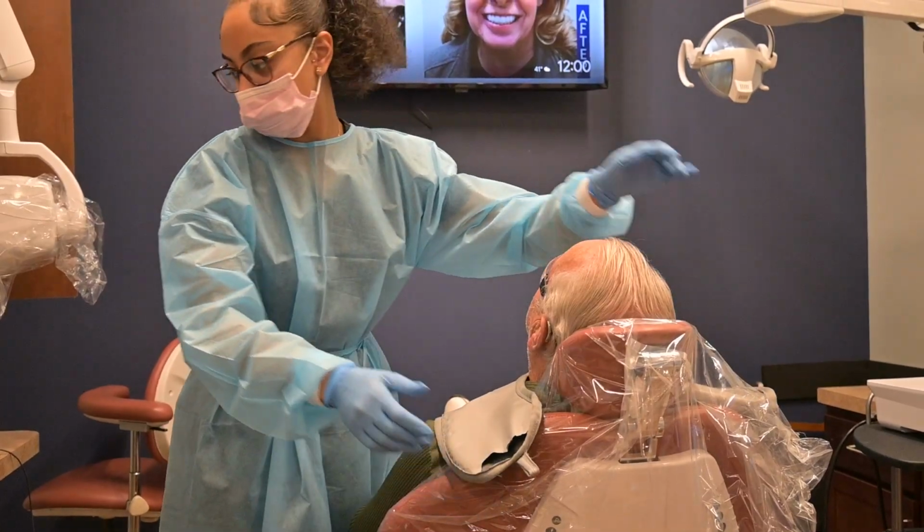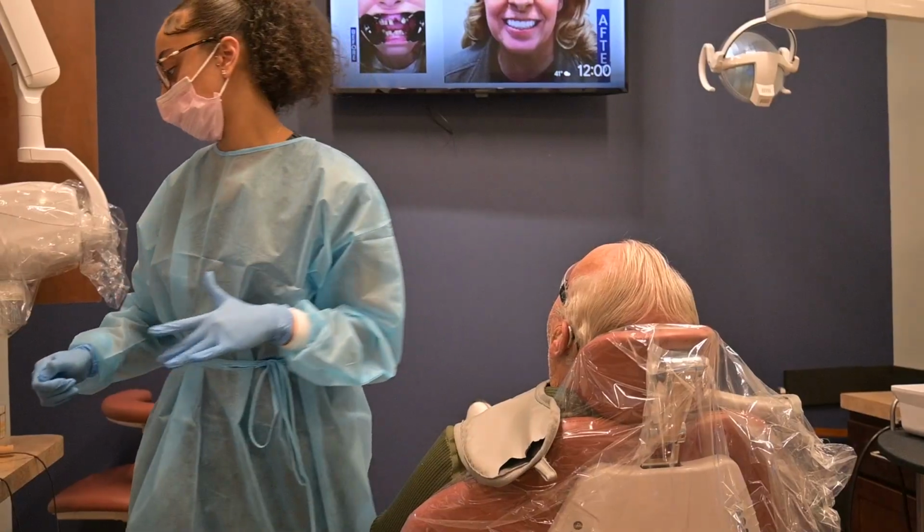So when we go to the surgery, we know exactly what we're going to be doing, because we're planning everything in computers, in software. That allows us to actually see the outcome before even touching the patient, before even opening the gums and placing the implants. We just know exactly what we're going to see.